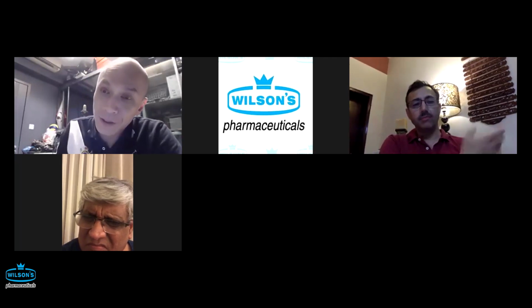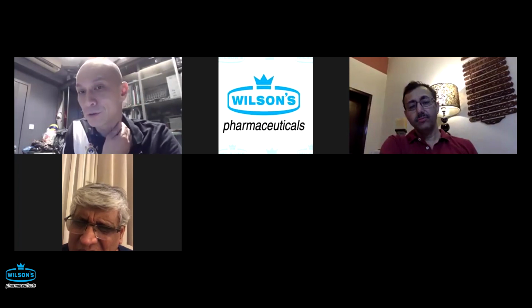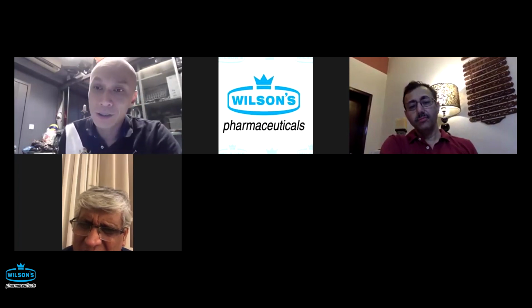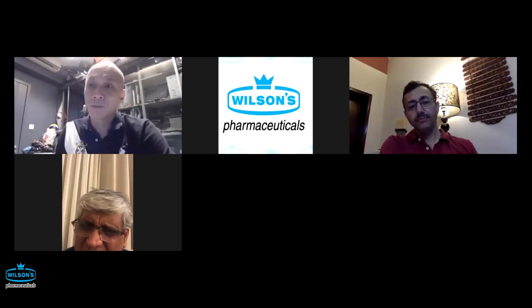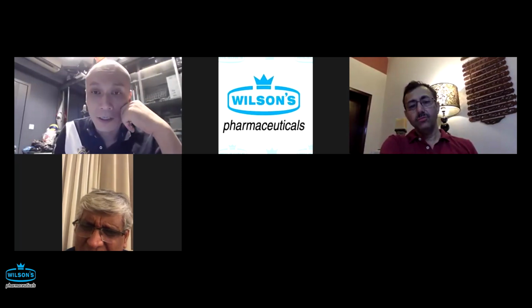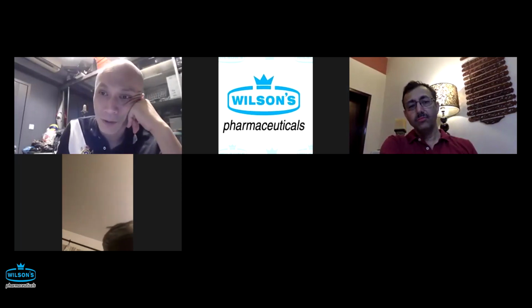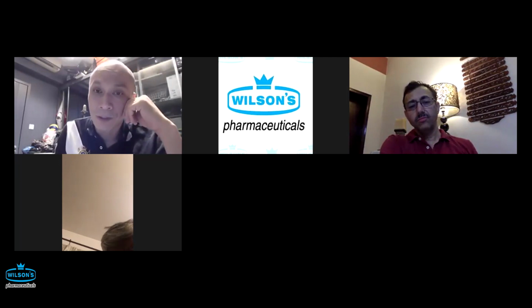Tailor this. In some patients, for example if they have coagulopathy, you really don't want to do a sphincterotomy, then you might choose to perform a small size sphincteroplasty. In those patients, I would dilate up to the size of the bile duct or the stone. But then you would try to keep the inflation for a bit longer.